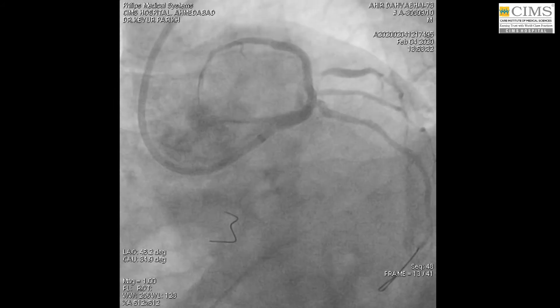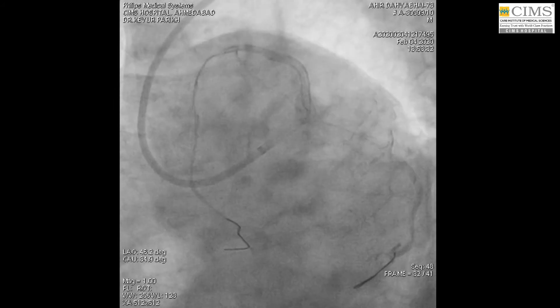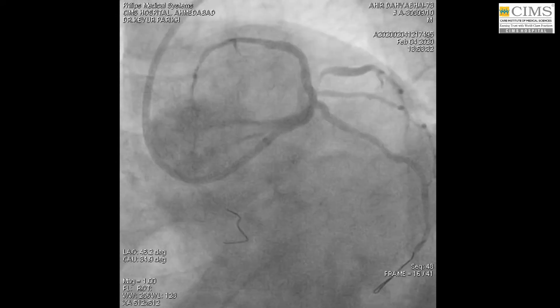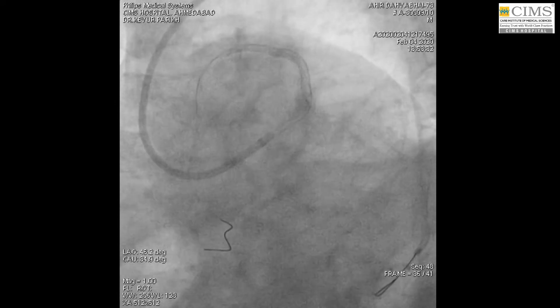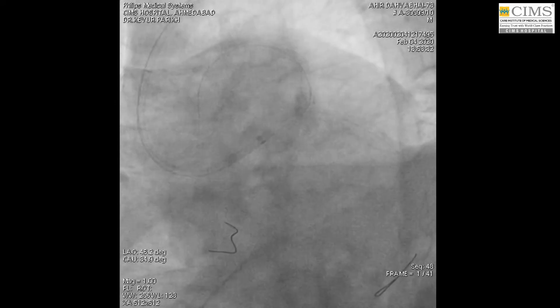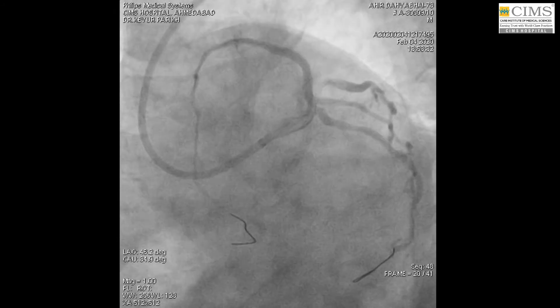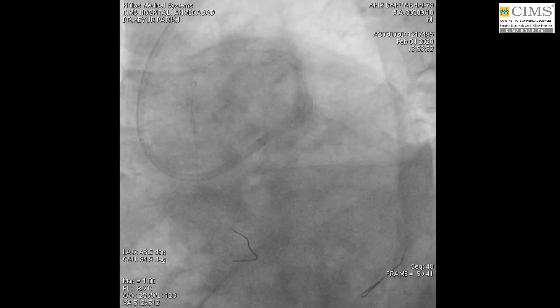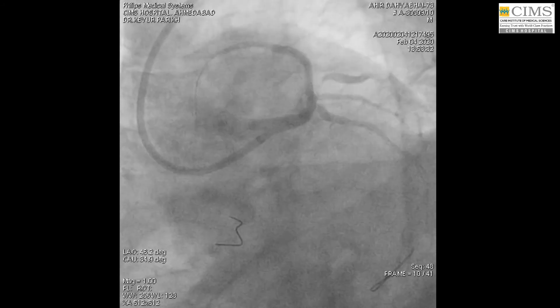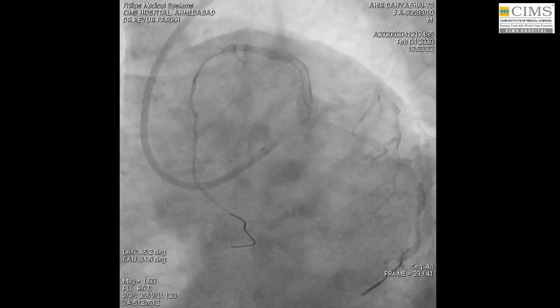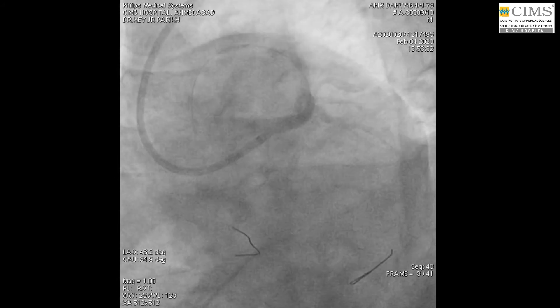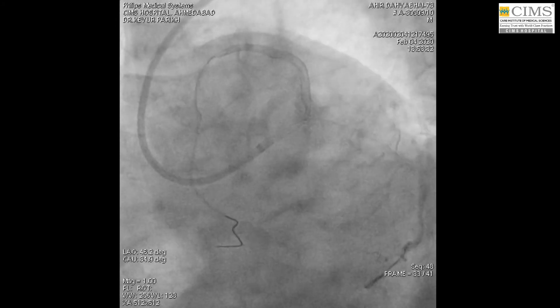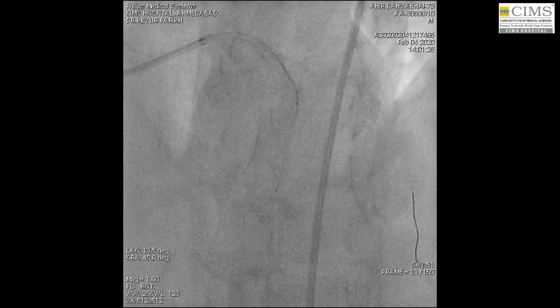The stent dilatation took approximately 30 seconds. As soon as we were done, we saw the large first diagonal at the quadrifurcation. As you can see, there is a left main, then a large circumflex, then a ramus, and immediately after the ramus is another large ramus or very high diagonal. The high diagonal shows significant stenosis which was not there originally. The question that arises is: what happened — is this a thrombus which got dislodged or something else? We have gone ahead with a repeat OCT to investigate.